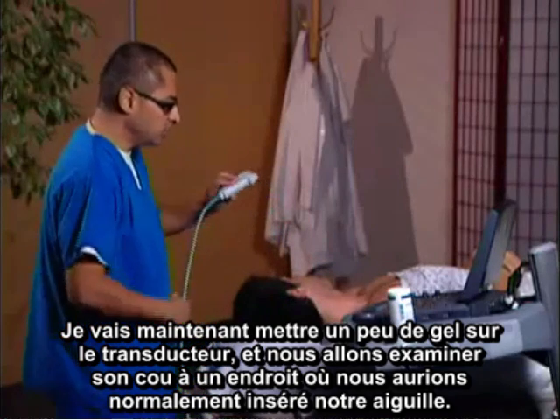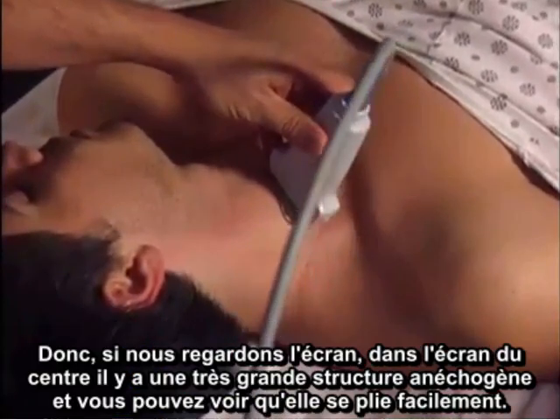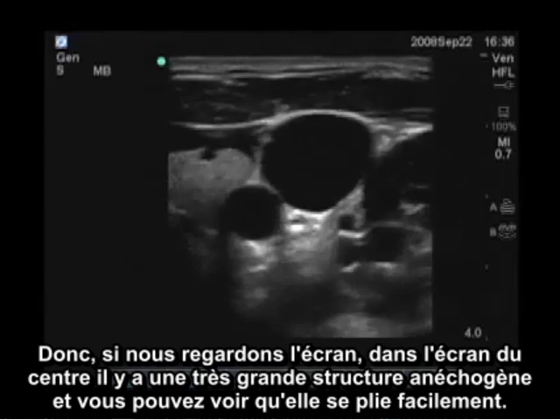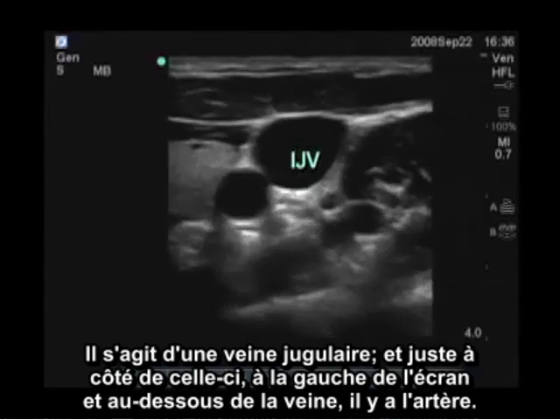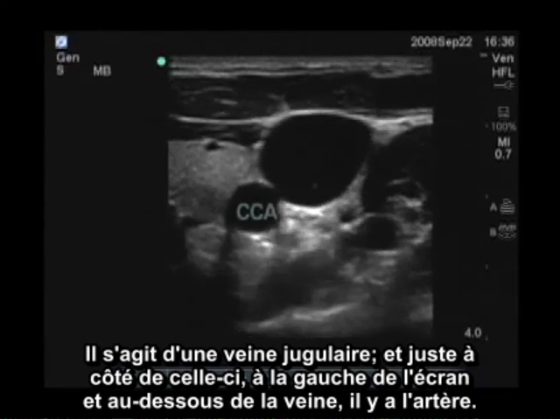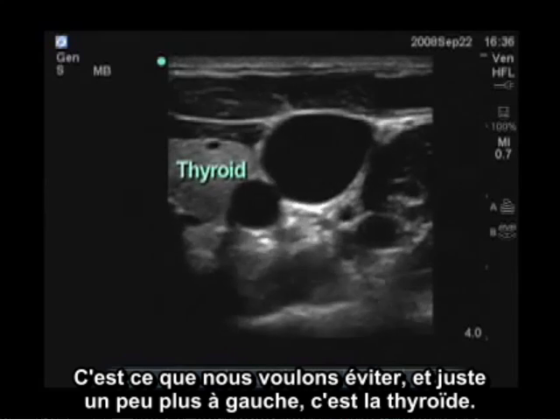And now let's take a look at his neck in a normal place that we would normally have put our needle. So if we're looking at the screen, in the center of the screen is a very large anechoic structure. And you can see that it easily collapses. This is the jugular vein. Just adjacent to this, to the left of the screen and below the vein is the artery. That is what we want to avoid. And just a little bit more to the left of that is the thyroid.